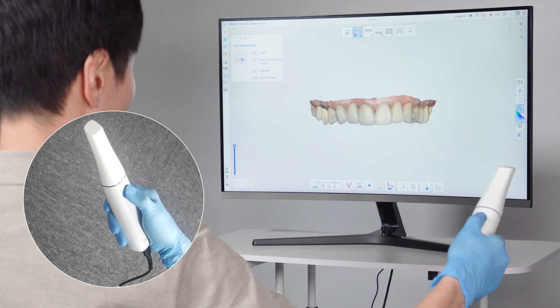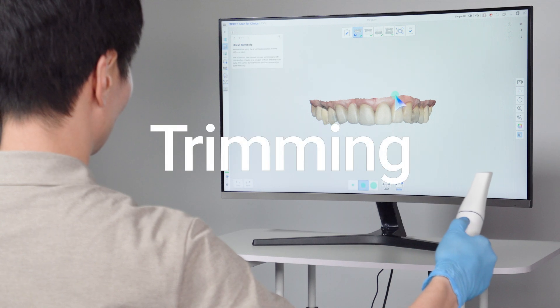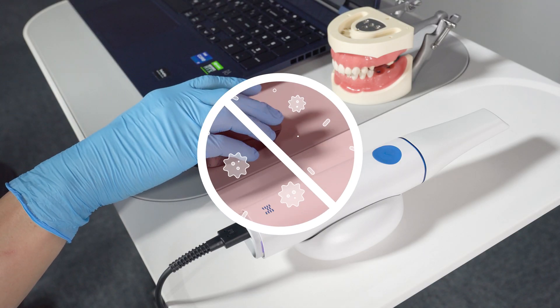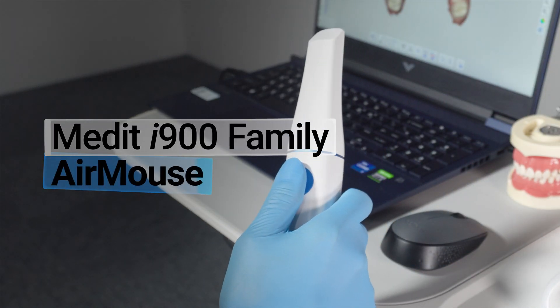Click the icon again to disable it. You can also use main toolbar tools like trimming without a mouse. This option enables more hygienic and convenient work without touching a mouse in clinical settings. Experience a faster and easier scanning experience with the Air Mouse.